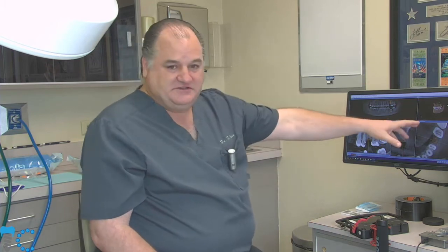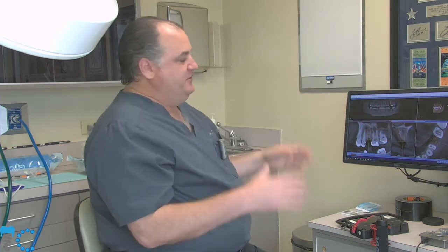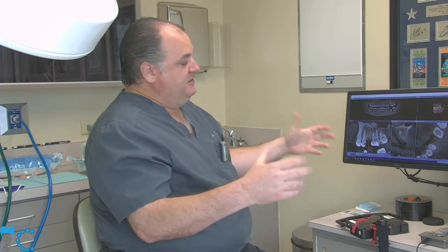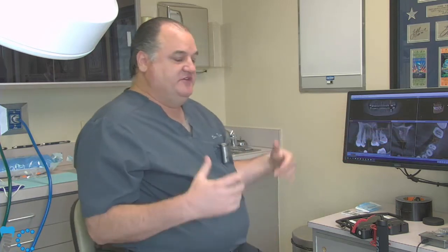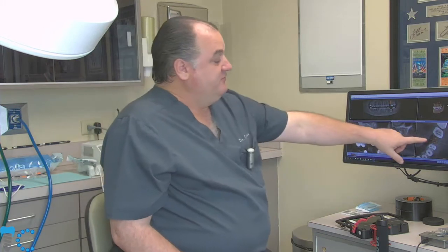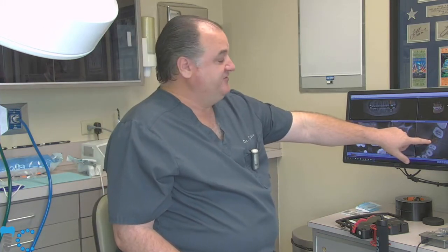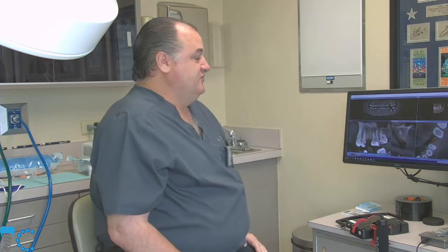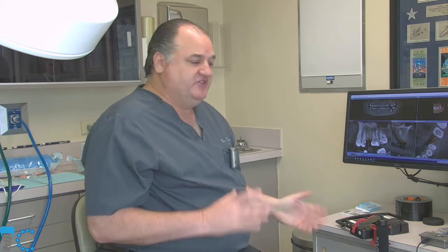Placement's especially critical with molars because the potential for increased overhang off the side of your implants is much greater. For example, what do I mean? The collar of a 5mm implant is 6 millimeters. The average mesiodistal width of a molar, be it maxillary or mandibular, is 10 millimeters.